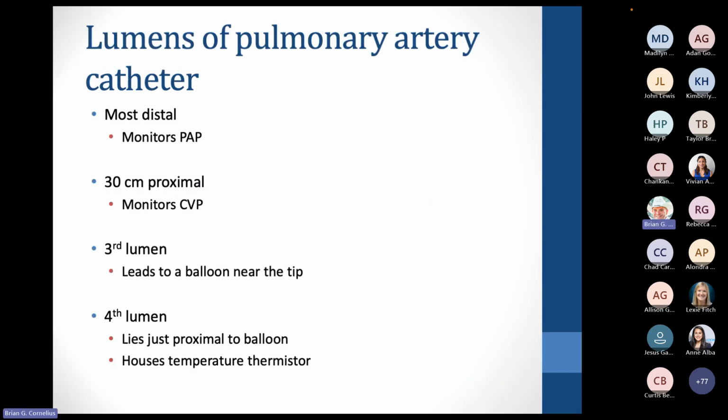This is just kind of an overview of the different lumens that we were talking about. We'll talk a little bit more about how these work in just a second as we look at the waveforms as it moves through the heart.